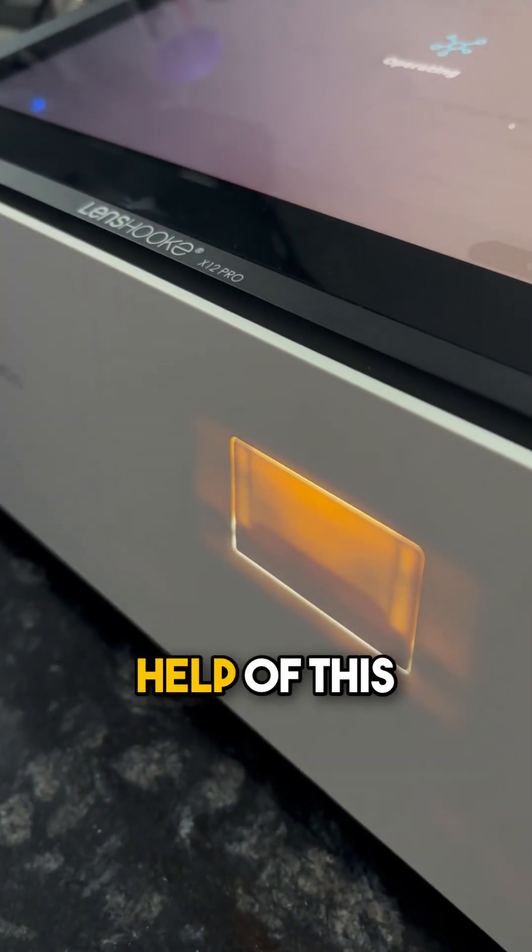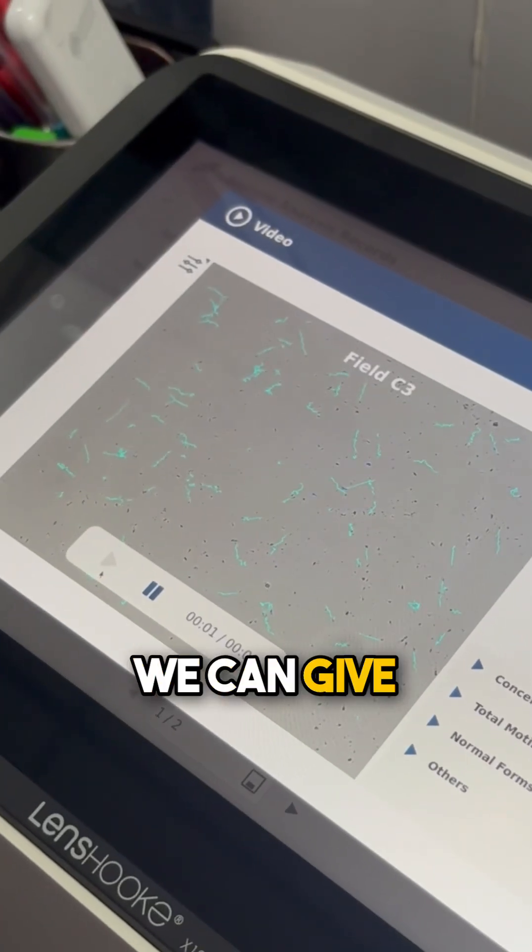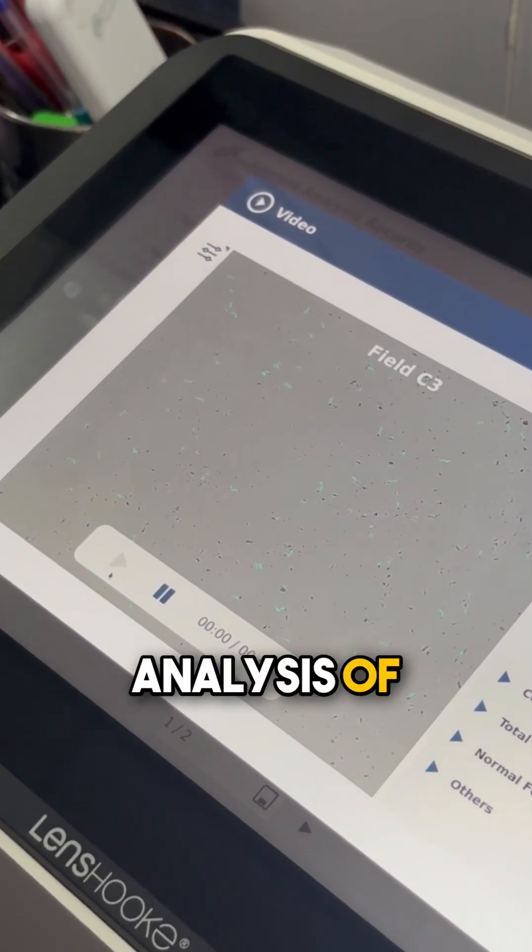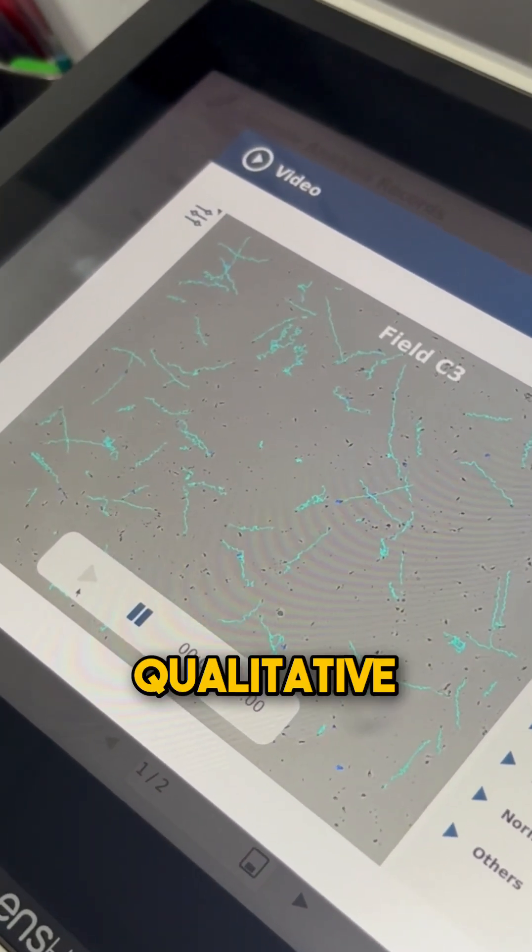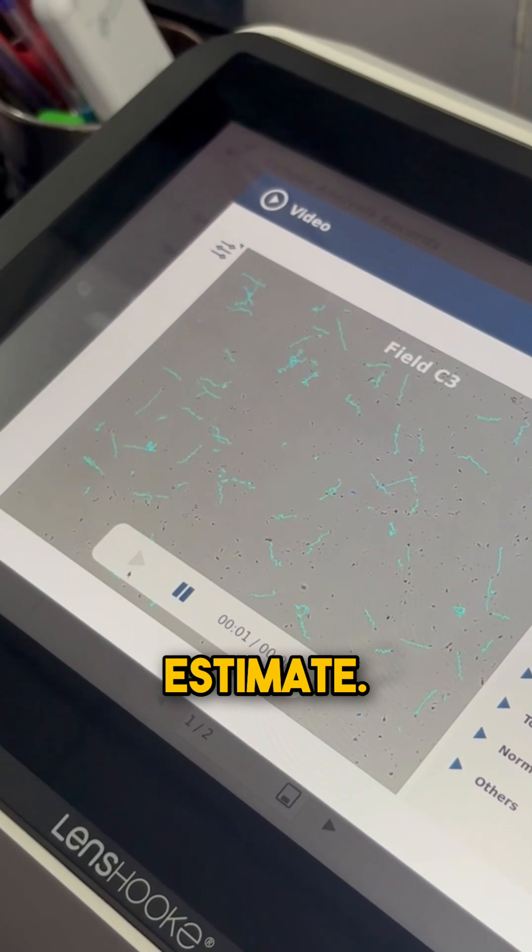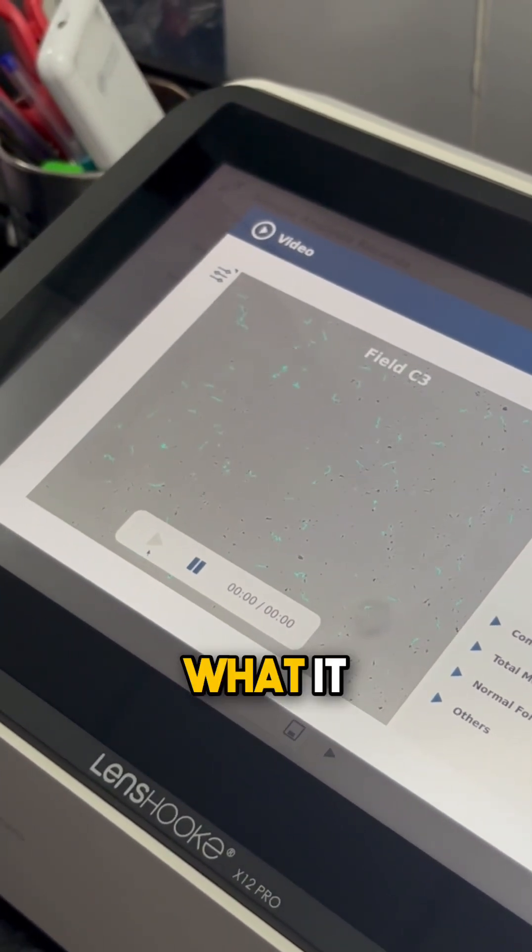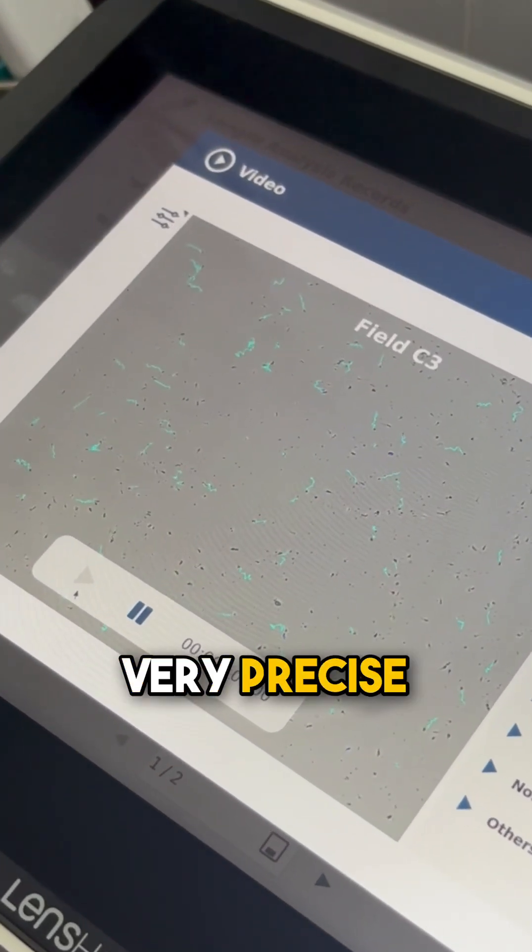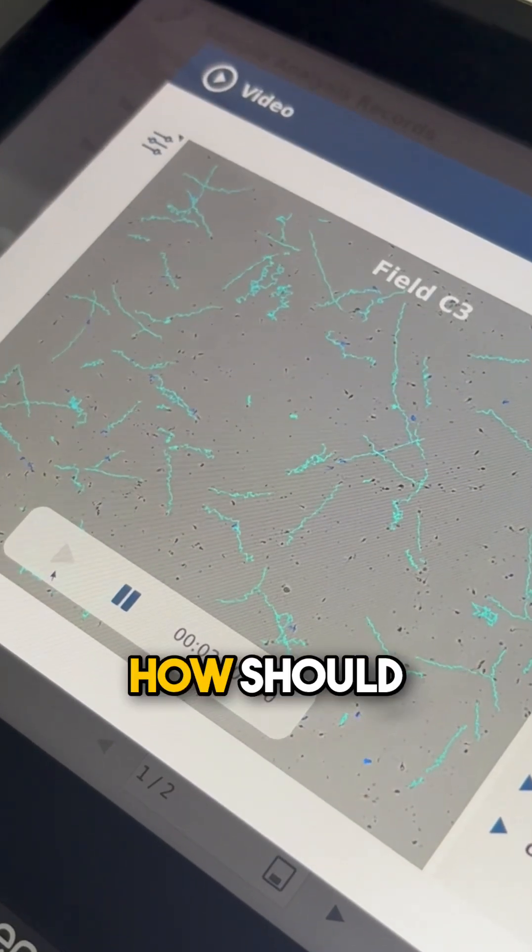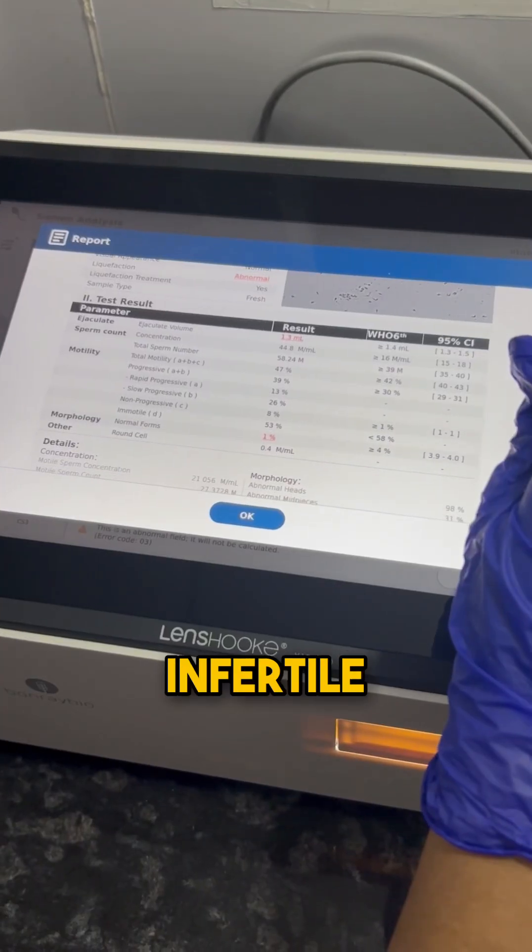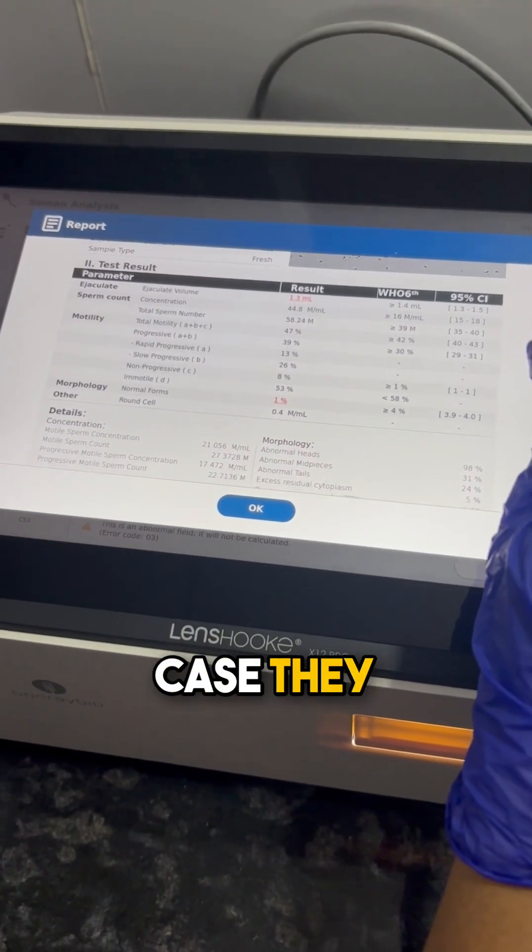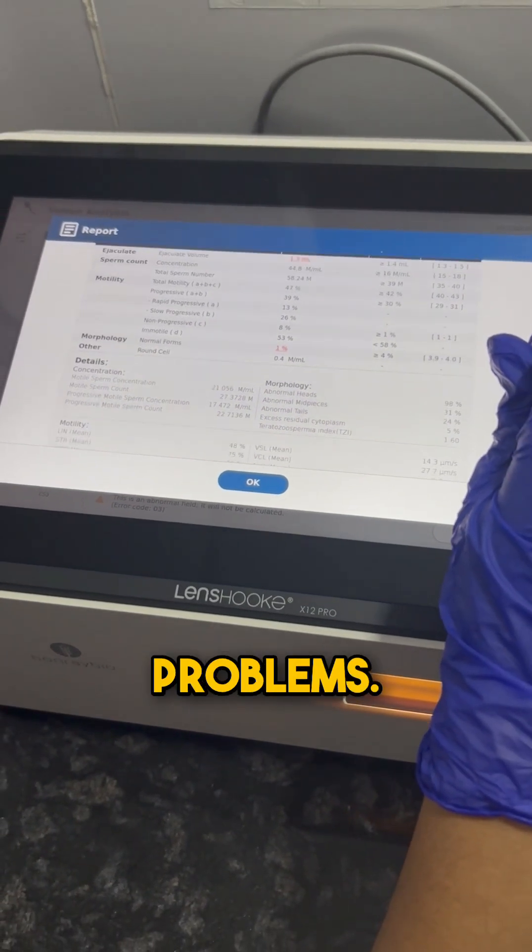With the help of this machine, we can give a complete analysis of sperm in terms of both qualitative and quantitative estimates. In turn, what it helps with is giving a very precise estimate regarding how we should treat a particular infertile couple if they have male infertility problems.